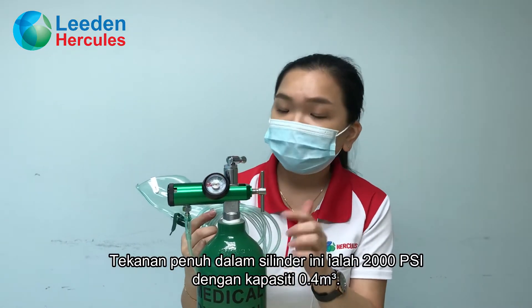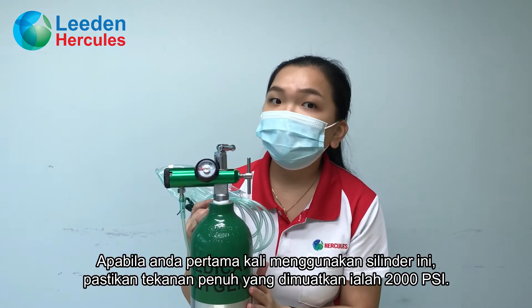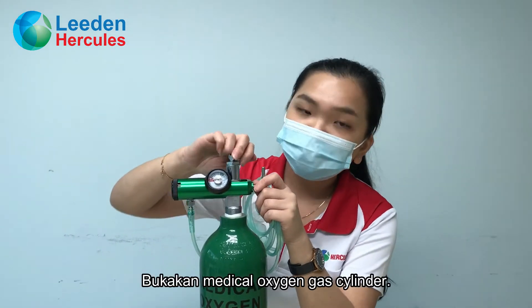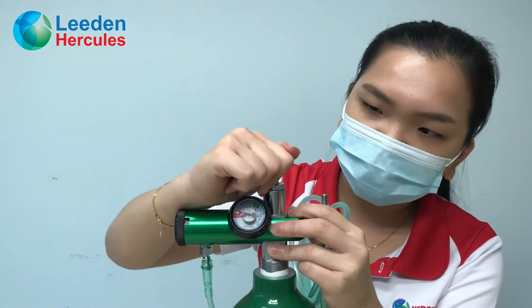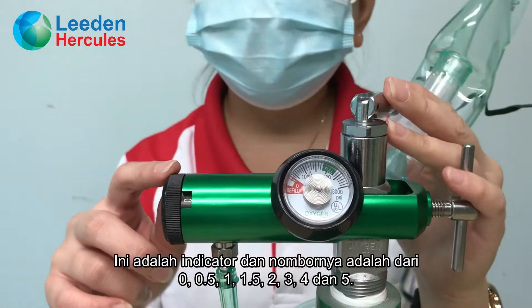The full fluid pressure of the cylinder is 2000 psi with a capacity of 0.4m³. Before using the cylinder for the first time, please make sure the pressure of the cylinder is 2000 psi. Turn on the medical oxygen gas. You can see the pressure of the medical oxygen gas is showing here on an indicator.